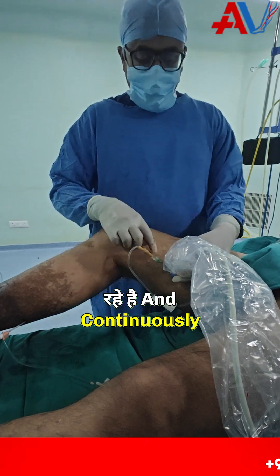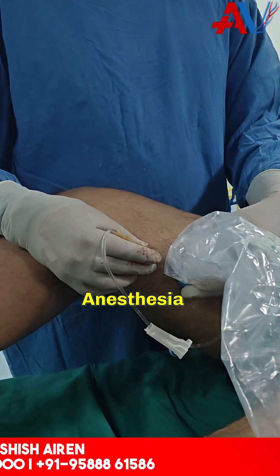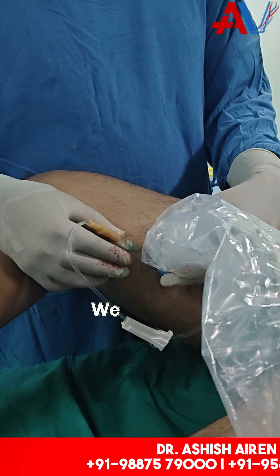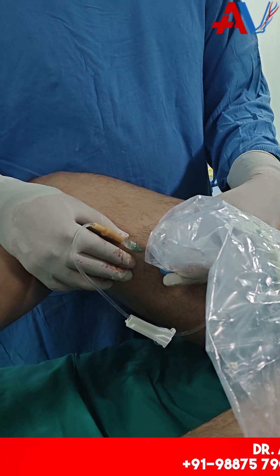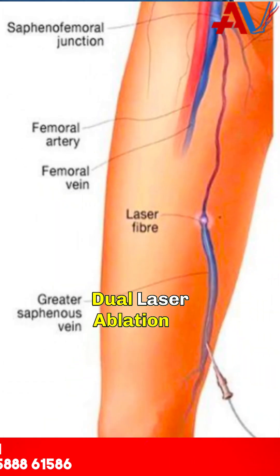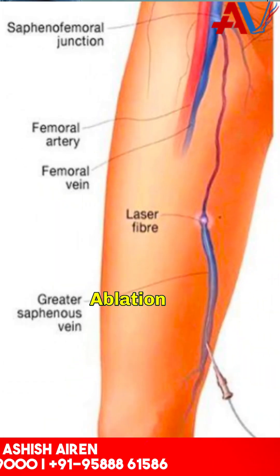Continuously with the needle, tumescent anesthesia. And then we plan to do a laser ablation. This is an ablation.